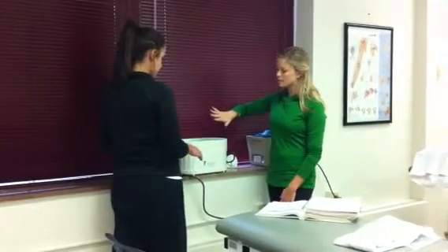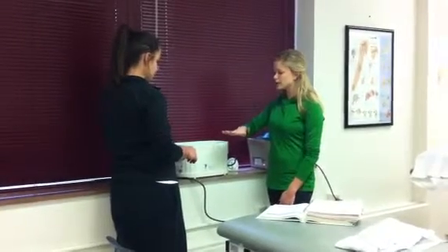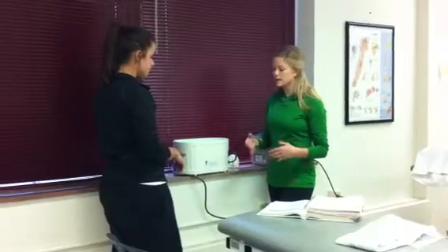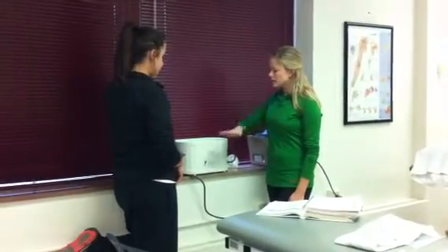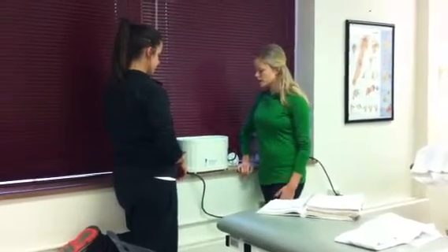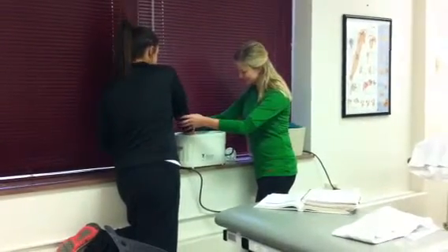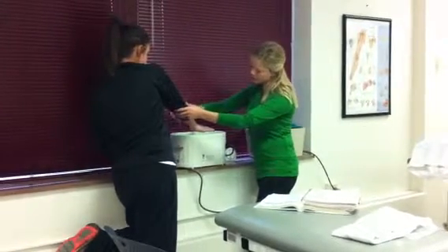When she dips her hand in, make sure that the patient's fingers are spread out. You want your fingers spread out and try to keep your hand in the same position the whole time so that it doesn't crack and let in the hotter wax. Try to dip it in as far as you can and leave it for two to three seconds, then bring it back up. We'll let that dry.